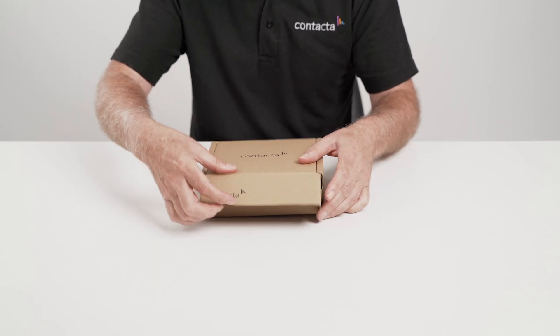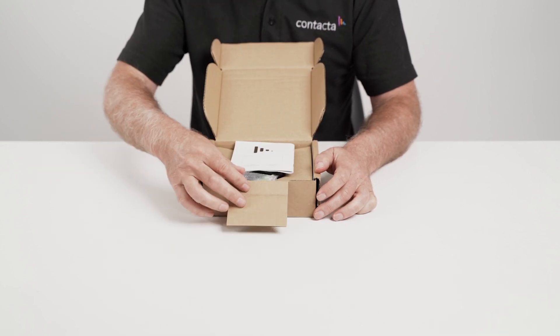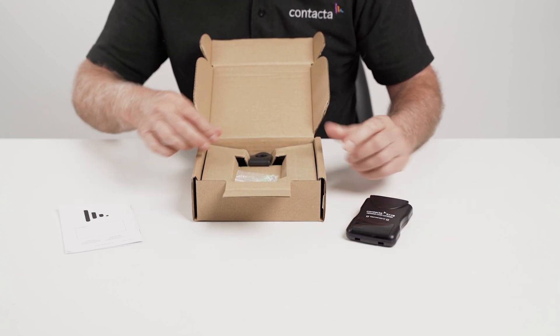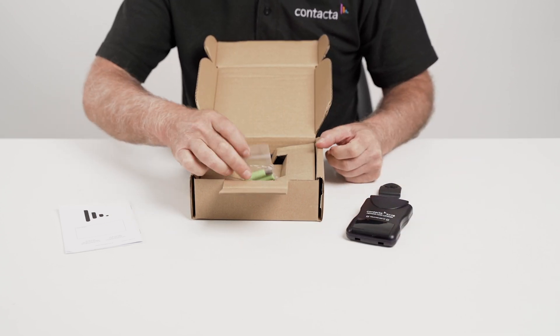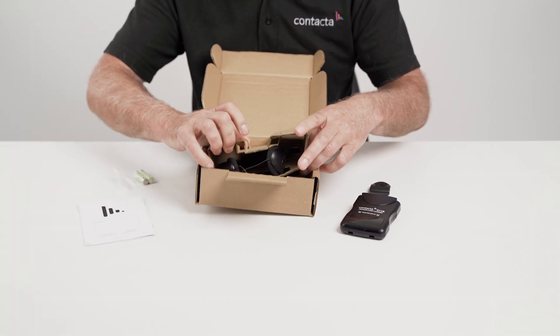When purchased, the RX30 will come boxed like this. Inside the box you will find a user manual, the RX30 receiver device including a lanyard with an attachment clip, a belt clip, a set of two AAA rechargeable batteries, and a pair of headphones.